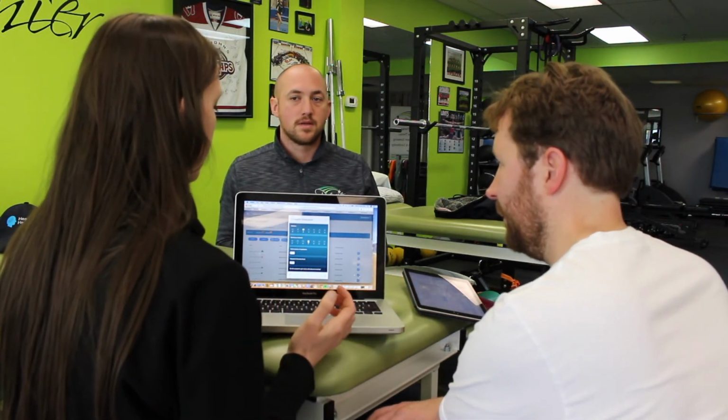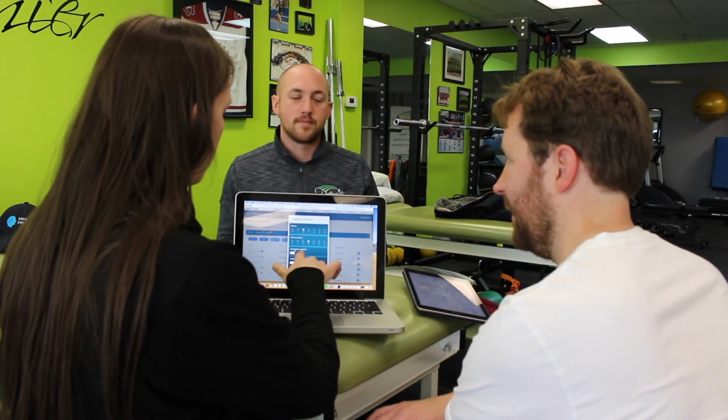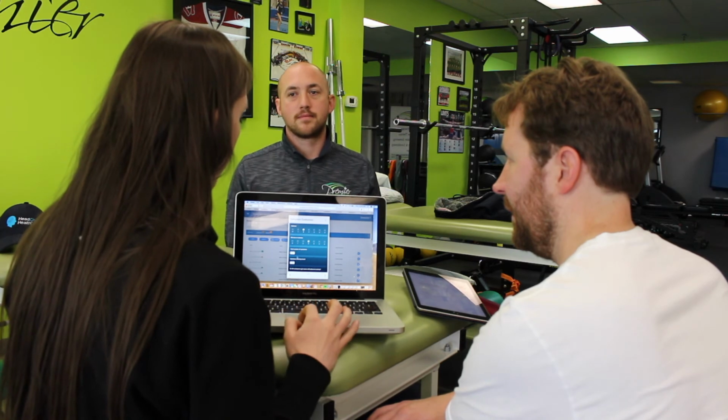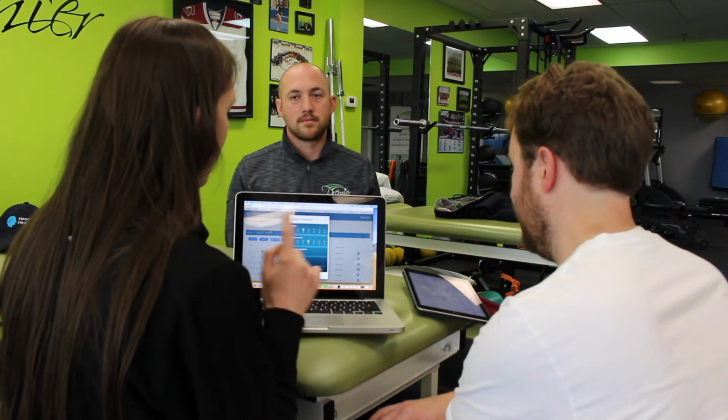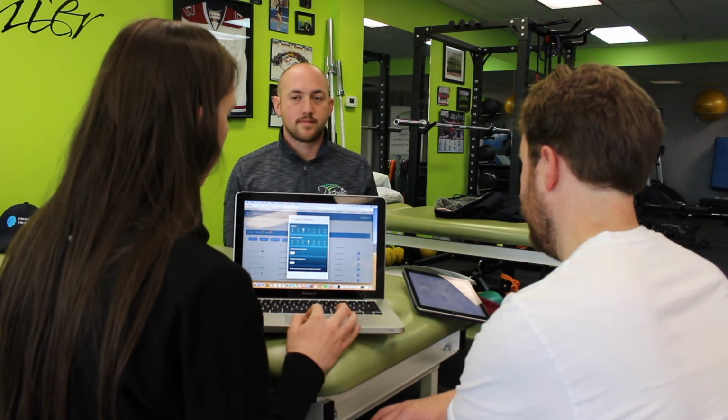So when we use the paper version of the SCAT5, we've got to add up all of those symptoms. Not that that's challenging, but for HeadCheck, it just does the work for us. So the total number of symptoms that Matt reported was 9, and the symptom severity score, based on the numbers he gave me on that scale from 0 to 6, is automatically calculated as well.